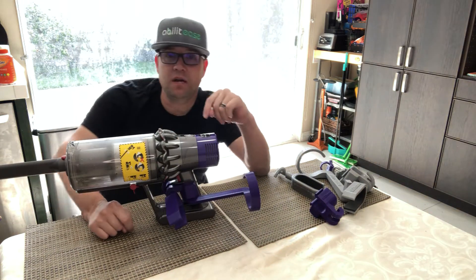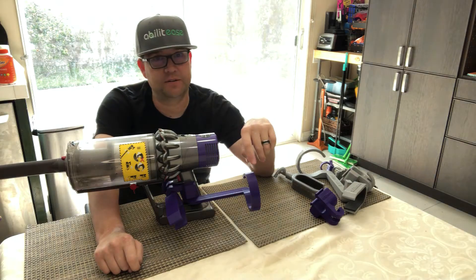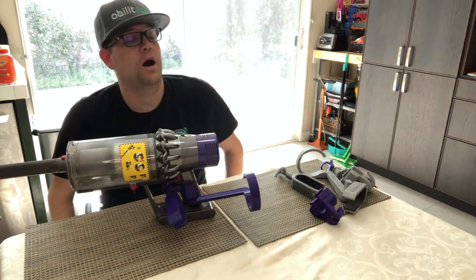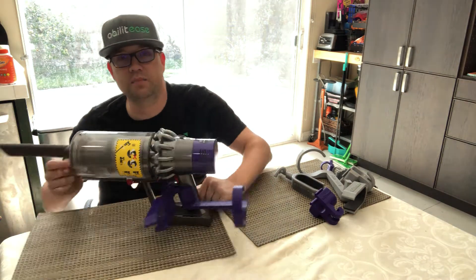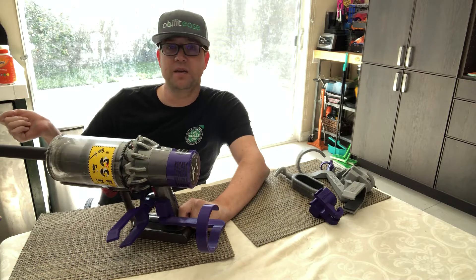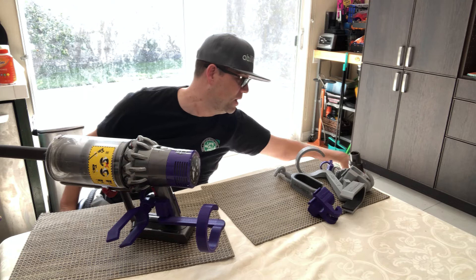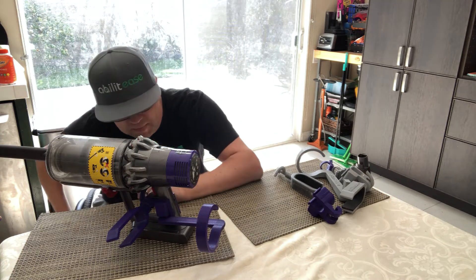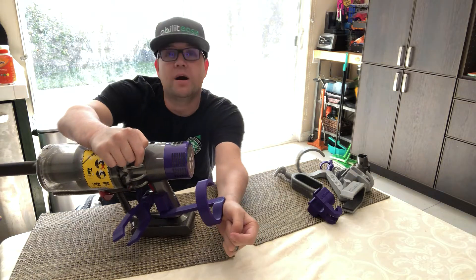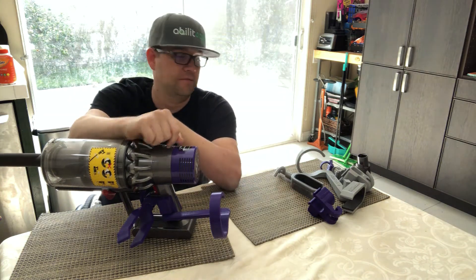At least this is a start — it gives you an opportunity to use a nice piece of equipment like this Dyson, and I welcome your questions and comments to make it better. Now because this is a handheld device, the back of the handle is exposed. If we attach the large attachment, this whole piece is going to snap off because of the awkward weight — it's long and that leverage forces the piece to pop off. So I had to go back to the drawing board.